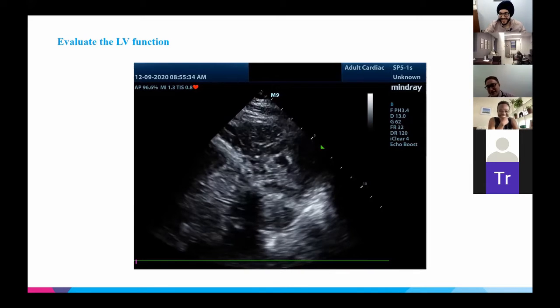I agree with everyone's assessments. I think as you'll find, hyperdynamic might be one of the easiest things we could figure out. Usually it'll be most commonly seen in someone with something like septic shock or even hemorrhagic or hypovolemic shock. And so it'll be clinically apparent, but this will provide better definitive evidence that maybe the patient needs resuscitation. So excellent. All right.